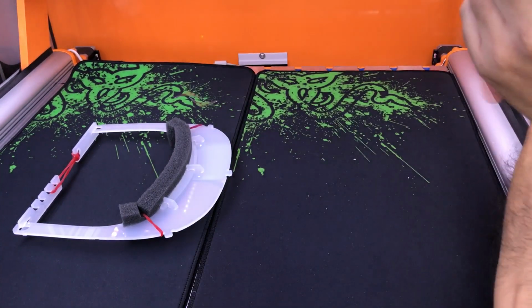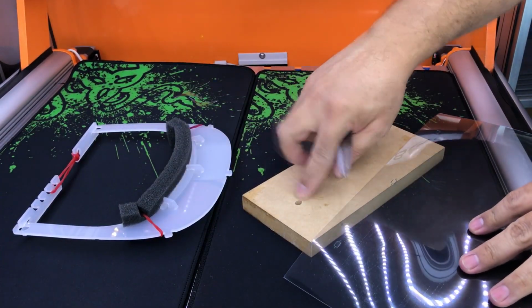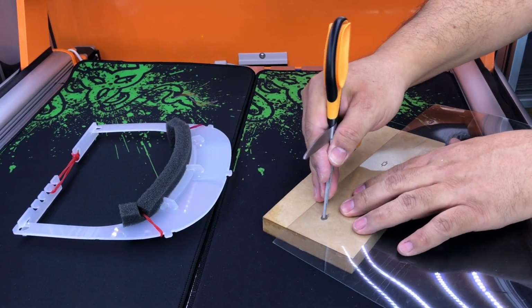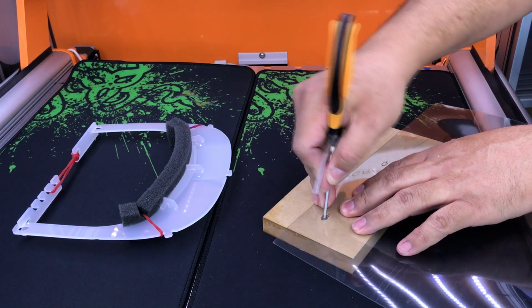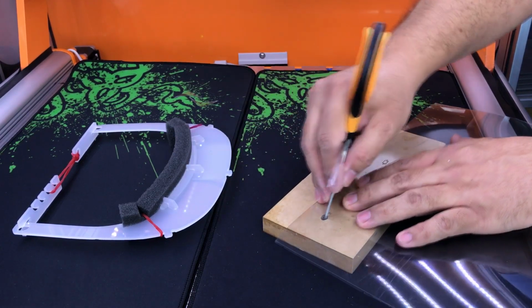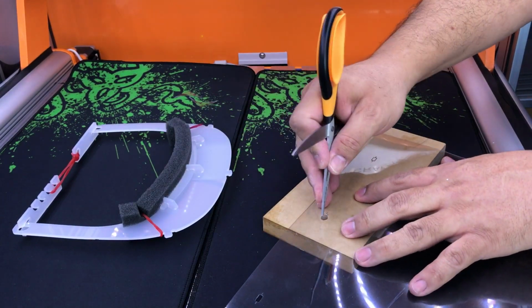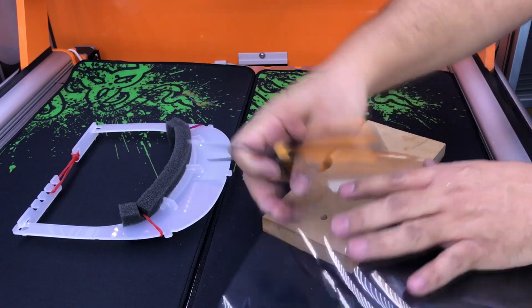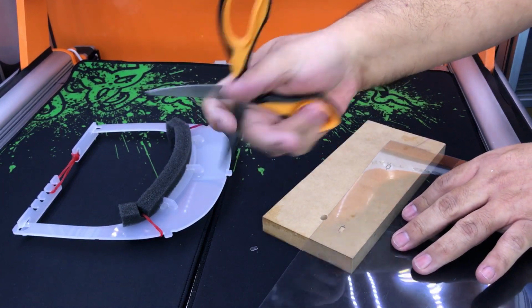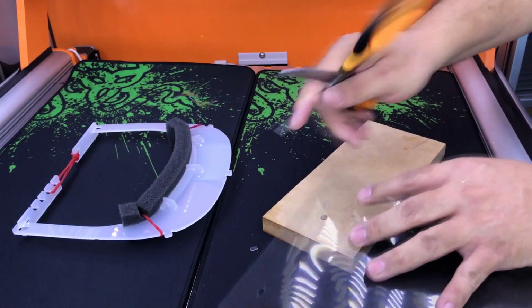Now, to remove the small cuts, you may need something with a small hole. For example, I'm going to use some scissors and press this like this. And there, let's remove it. Now the next one. Why do you need the hole? Because you need some support to remove this little leftover. There you go.